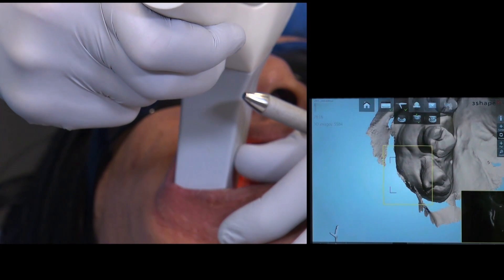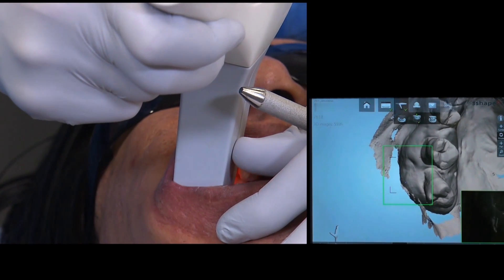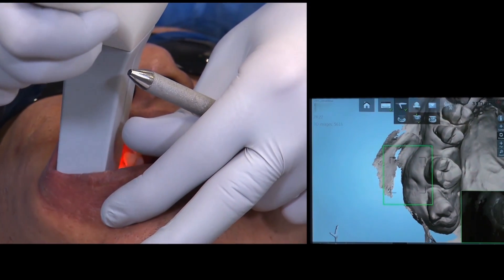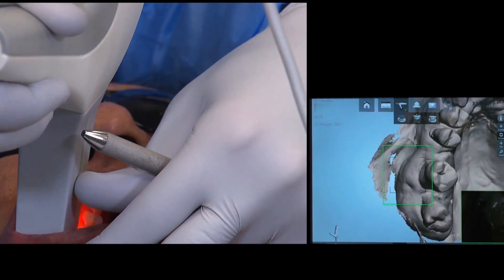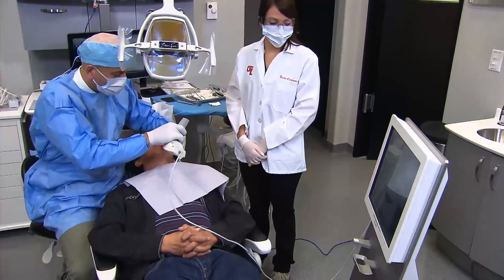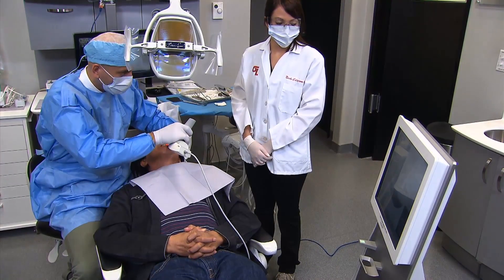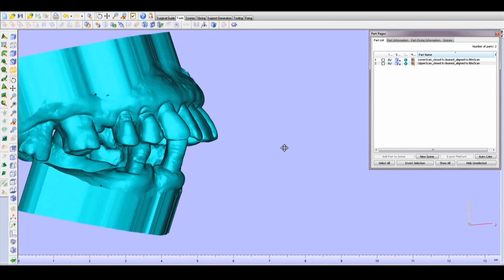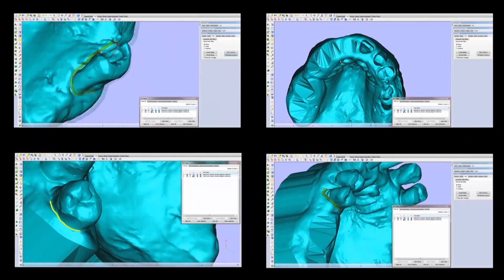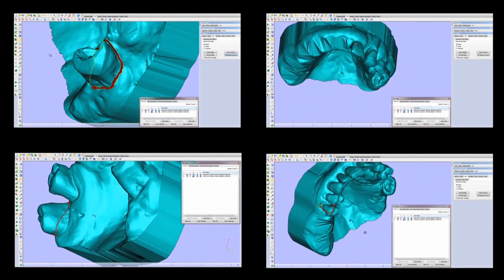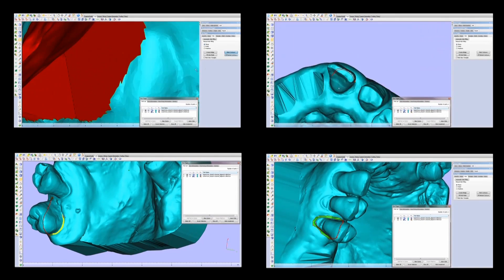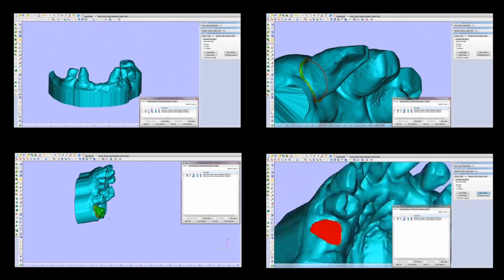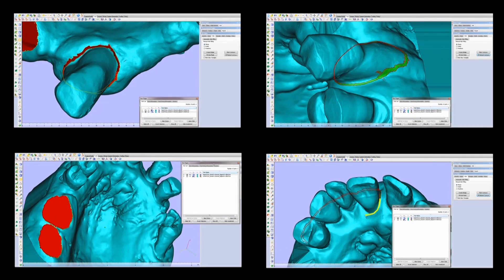As you can see on the screen, the impression making is made fairly easy using the scanner. The next step is to upload all the information captured from inside the patient's mouth onto software. It's uploaded and the denture is designed. Before the denture is actually designed, we digitally extracted the teeth — basically treating this case the same way as we would in the laboratory on a stone model.